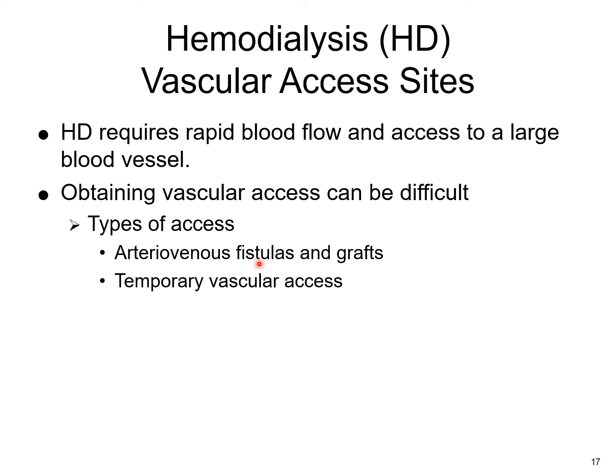So your biggest job is to always make sure that you're assessing the site and that it's good. And the other job is for us to protect that site. So if it's in the arm, we're putting up signs in the room saying, you know, no, you're not using that arm for anything, blood pressures, blood draws, making sure everybody can see that.